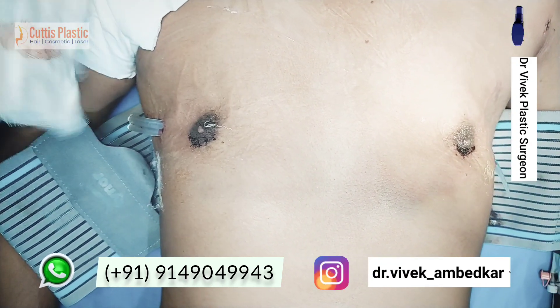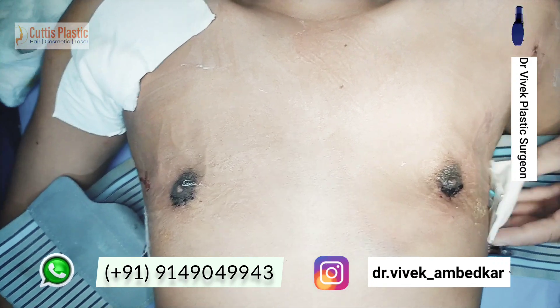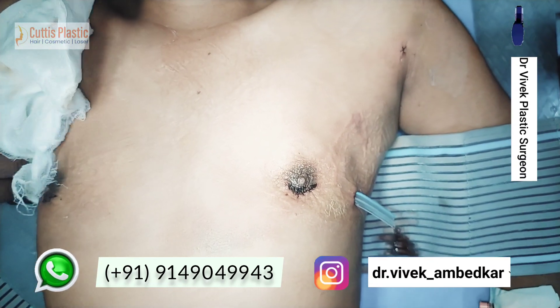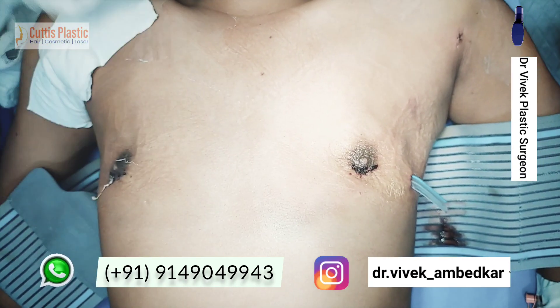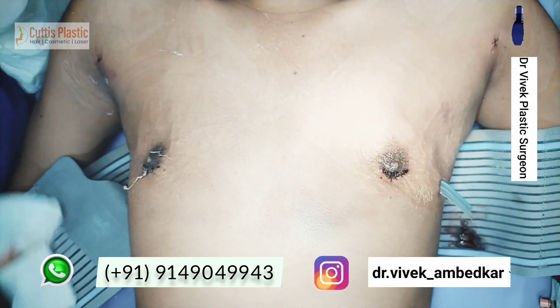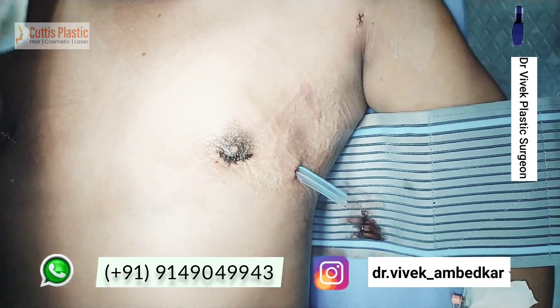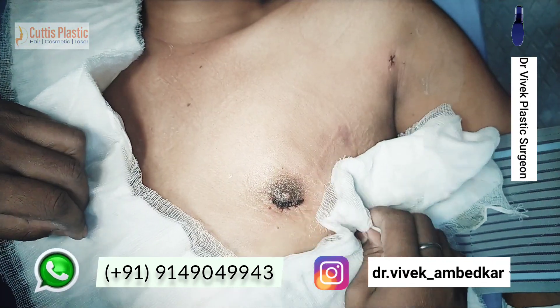So, this is the main purpose of the drain — it draws out the fluid so that blood and fluid do not accumulate inside. It is working a bit. That is the main purpose of the drain.